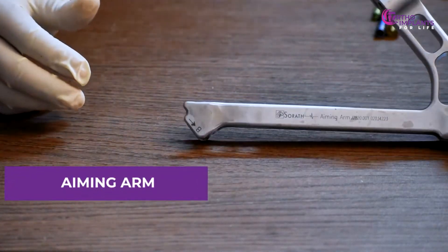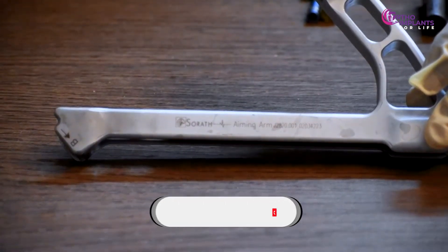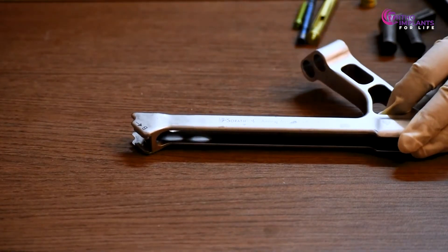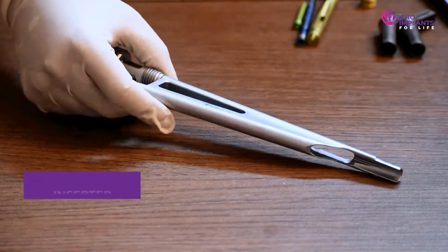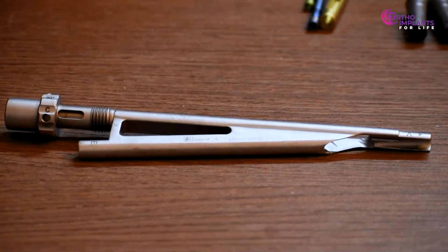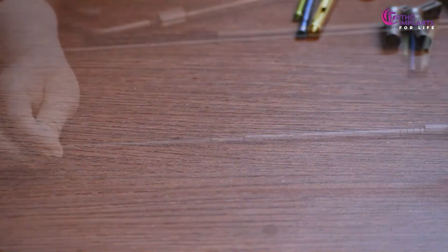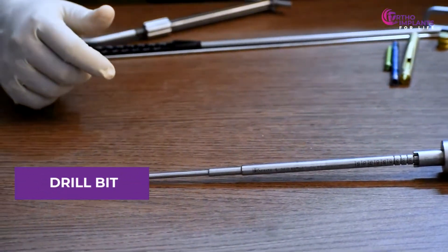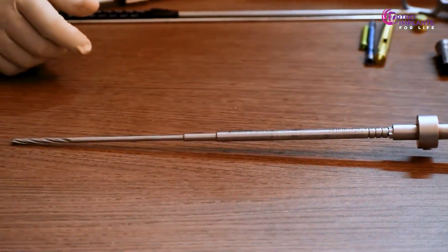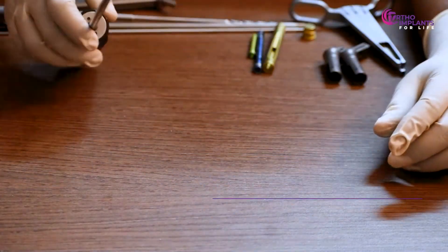Here's the aiming arm, followed by the inserter. This is the drill bit for the 5 millimeters locking screw. This is the star headed screw driver.